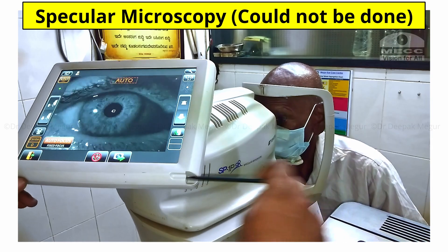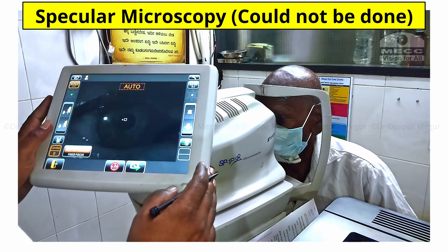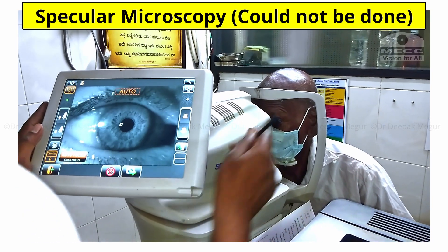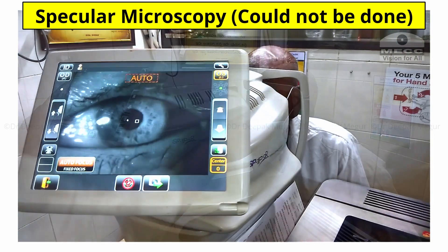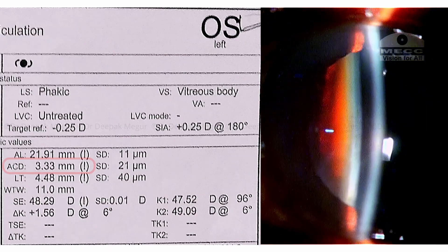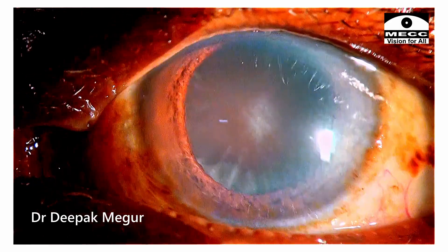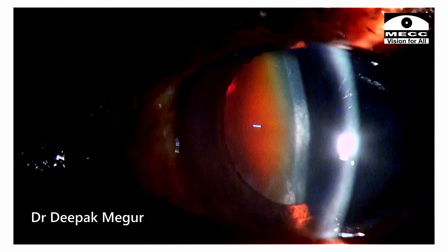We tried doing specular microscopy, which is a routine evaluation we do for every patient posted for cataract surgery, but the machine could not acquire images in this patient — perhaps because the patient was not fixating. This was quite disappointing. The biometry report shows the anterior chamber depth is adequate, not shallow, which was one good thing. I also looked carefully at the slit lamp examination for any evidence of zonular weakness, which was not present.